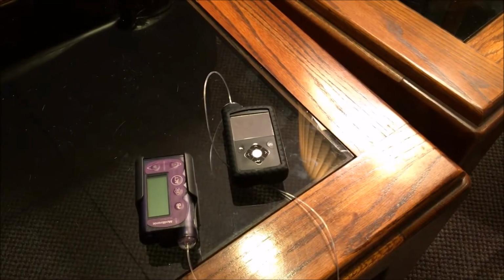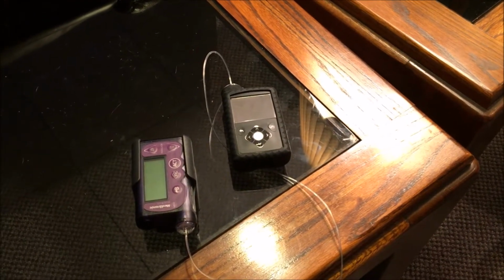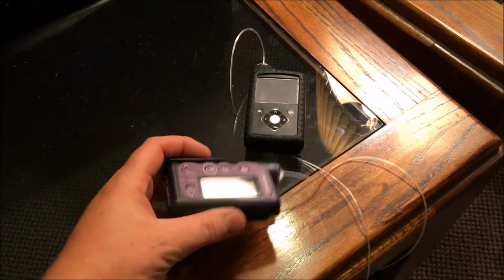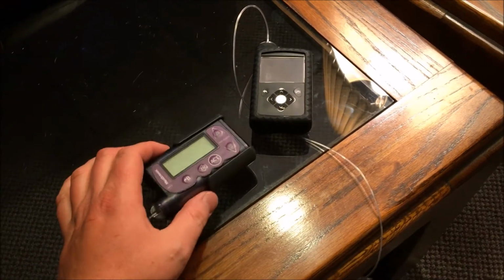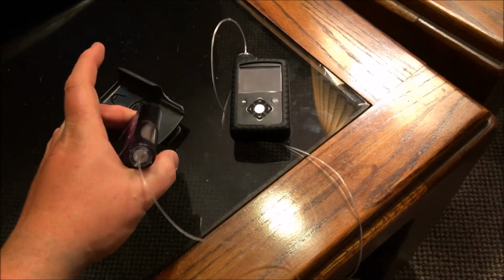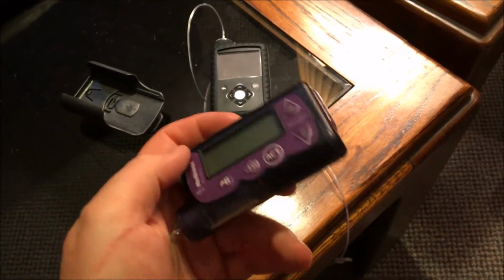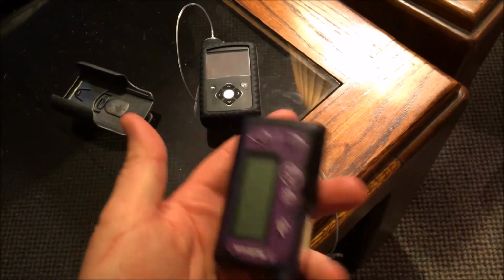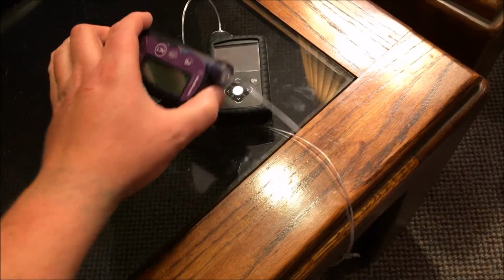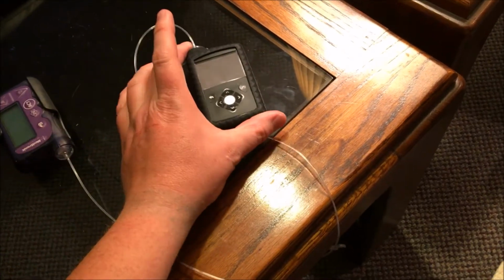Okay, this is the biggest difference for me. So one of my favorite things to do with my previous Medtronic pump is this I would wear on my belt or at my hip or whatever, and I would always leave this on the belt, and then I would take this out and I'd use my pump and then give myself my bolus or, you know, whatever I needed to do here. It was really nice because then I would just slip it right back in the holster and it'd be on my belt.